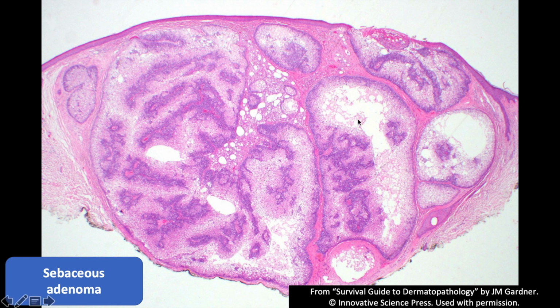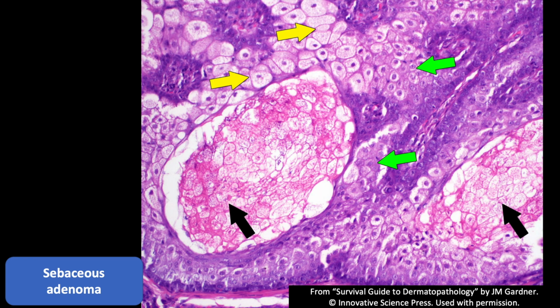When there is cystic change in a sebaceous adenoma, there have been some studies suggesting that that's more highly associated with Muir-Torre syndrome. And sebaceous adenomas, again, they have a more prominent layer of blue basaloid germinative cells. Scattered mitoses are a common finding, I would say. I find that oftentimes in sebaceous adenomas and sebaceomas, you will get the big clear sebocytes like you see in sebaceous hyperplasia, but you tend to have a lot more of these somewhat immature sebocytes.